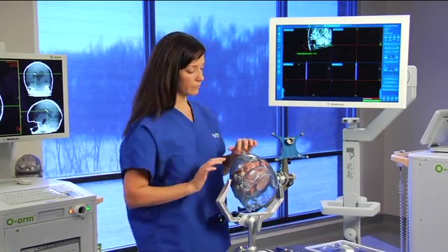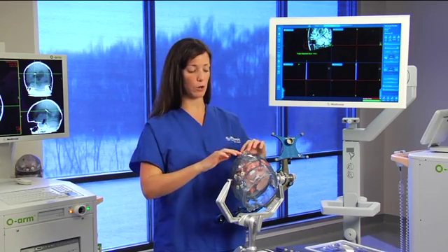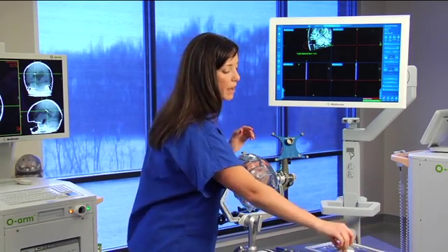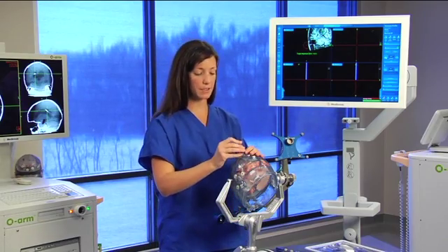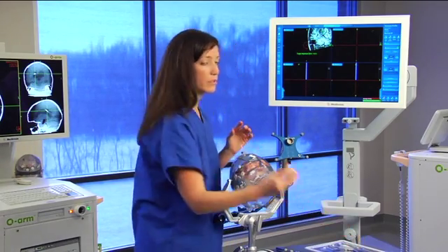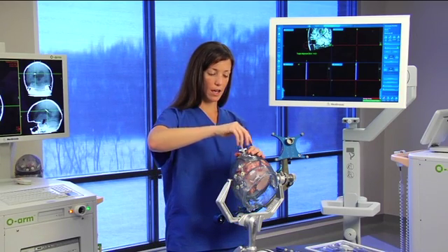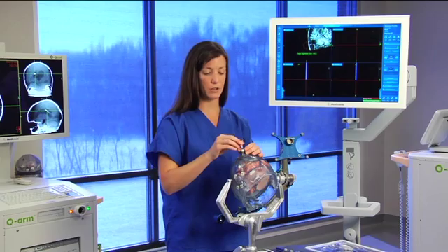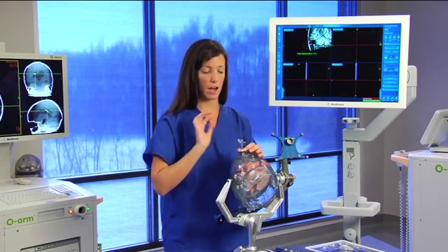At this point, I would go ahead and make a burr hole and attach the Navigus base. Once I have that done, I'm going to take the guide stem and snap that into place. Then you want to take the locking ring and tighten it down just enough so that you get purchase and you can still move the guide stem.